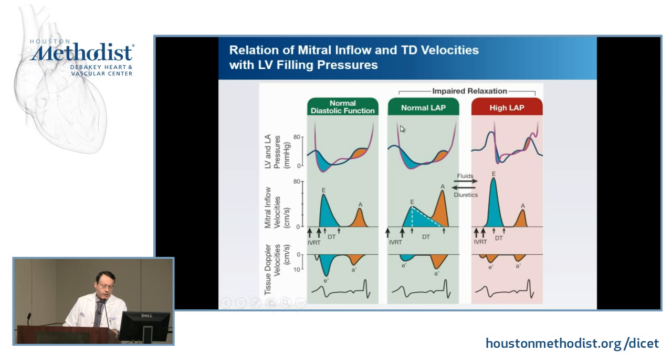If the ventricular pressure is slow to decline, you end up with a higher minimal LV pressure. As a result, with the LA pressure that is not elevated, that gradient, that space of the curve is smaller in area. And then you have a lower E, a longer time for that E to dissipate, a longer time for the velocity to rise, a longer IVRT. Now comes the time of atrial contraction. The atrium has not emptied much blood. The atrium follows the Starling mechanism, if you would, and now contracts more forcefully, gives you that larger A wave.